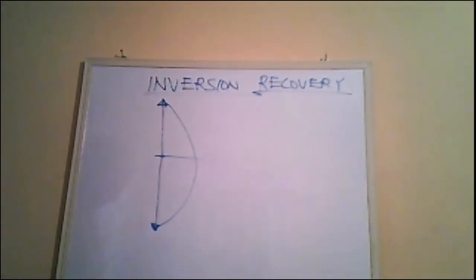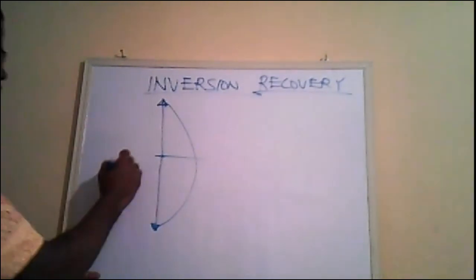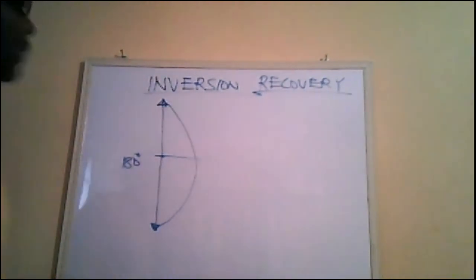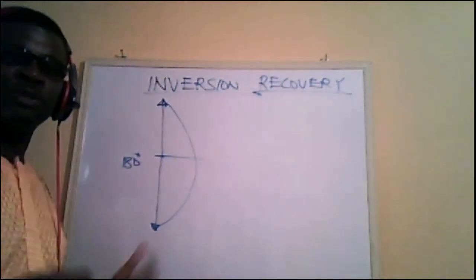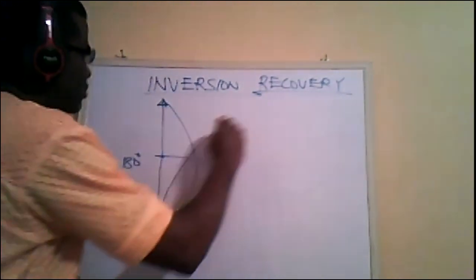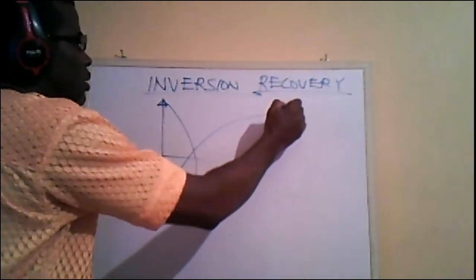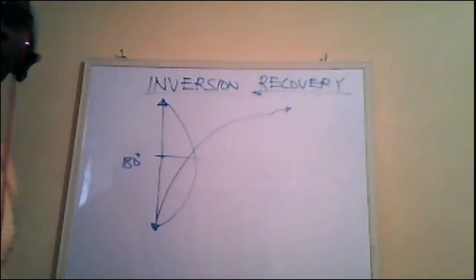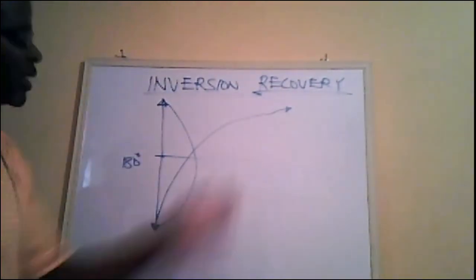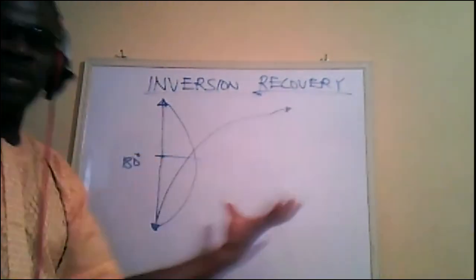After the application of the 180 pulse, and the 180 pulse is removed, you now have growth, T1 growth, of longitudinal magnetization. Nothing happens along the transverse plane, no magnetization at this moment at any point in time along the transverse plane.